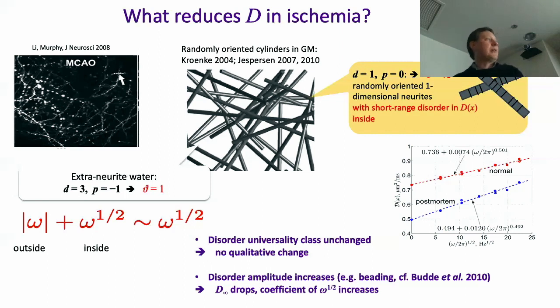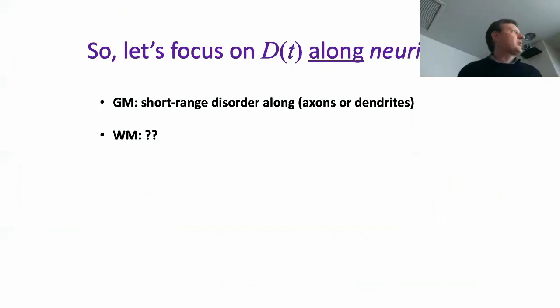But also at these very short times, we don't know much about the exchange, but presumably up to 0.5 kilohertz, a few milliseconds, exchange doesn't actually happen in a notable amount. There's a debate about what the residence time is, maybe 100 milliseconds or so, but you can roughly think of water being in one compartment or the other. At very low frequencies you may see something, but it's a very tiny effect. But I'll talk about exchange.